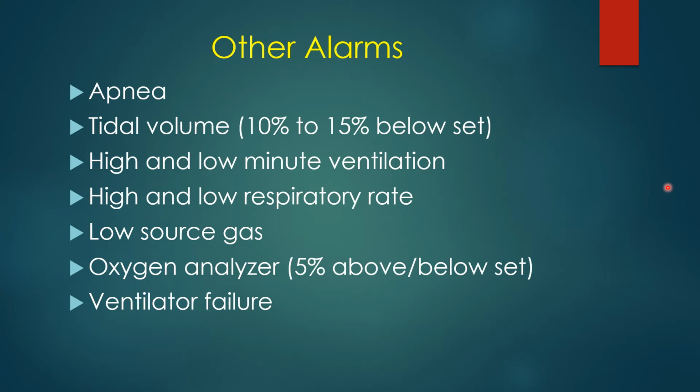On some ventilators, you have to take the patient out of apnea ventilation by pushing some buttons on the machine. Other ventilators will go back to letting the patient breathe spontaneously if he starts breathing. So you need to know the brand of ventilator you're using, how the apnea works on it, and all the details about it.